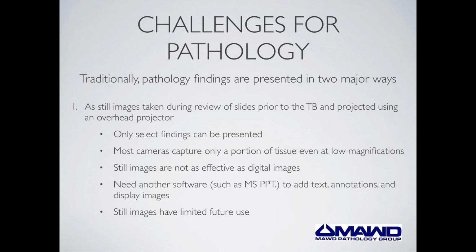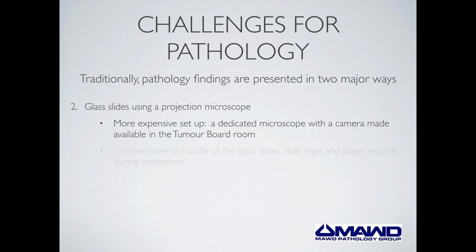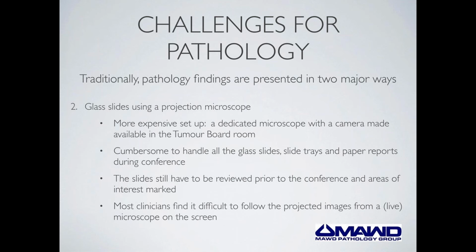And then once you capture those images, you need to import them into another software, such as Microsoft PowerPoint, for example, for adding text, annotations, and finally, to present at the tumor board. I believe that these still images are not as effective, and really, they also don't have any future use. So a lot of hard work that pathologists do prior to the tumor board essentially is ineffective and certainly does have very limited future use.